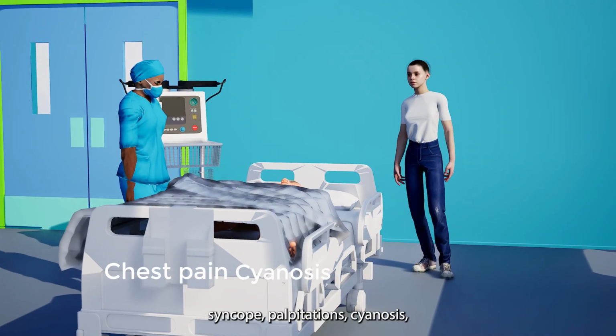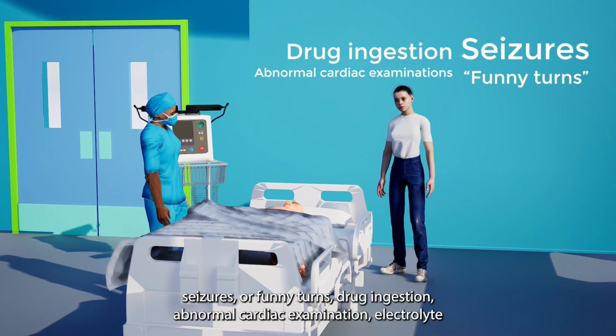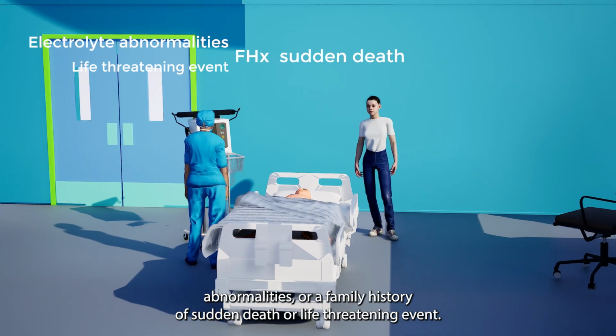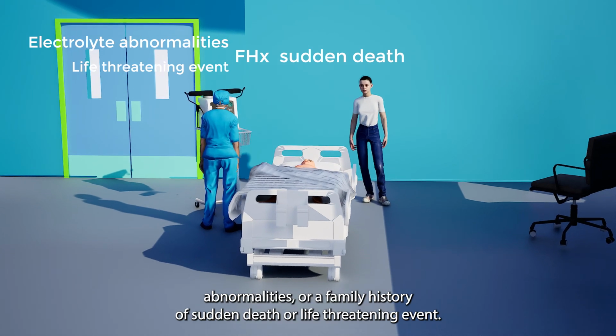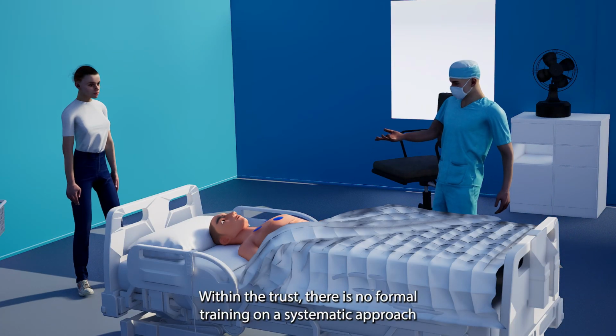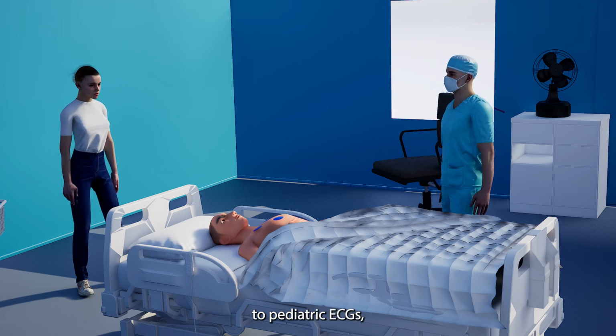Common indications for an ECG in children include, but are not limited to, chest pain, syncope, palpitations, cyanosis, seizures or funny turns, drug ingestion, abnormal cardiac examination, electrolyte abnormalities or a family history of sudden death or life-threatening event.